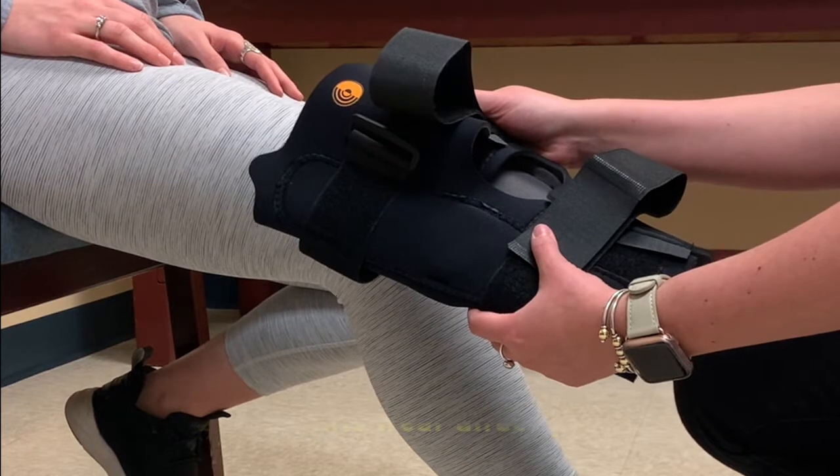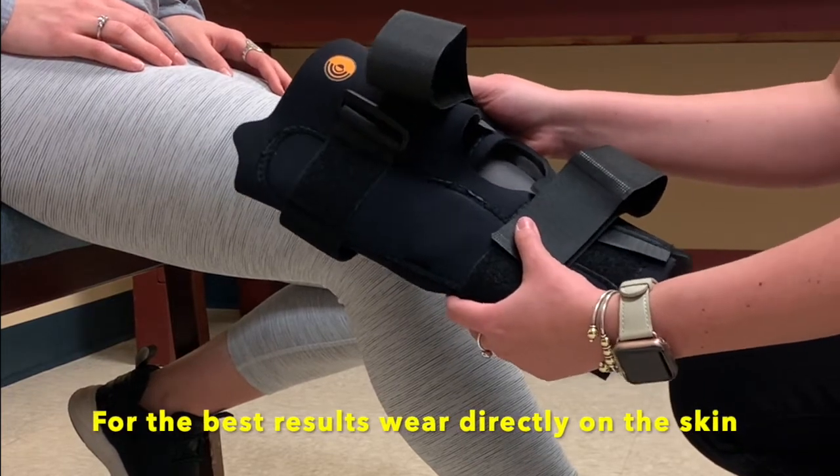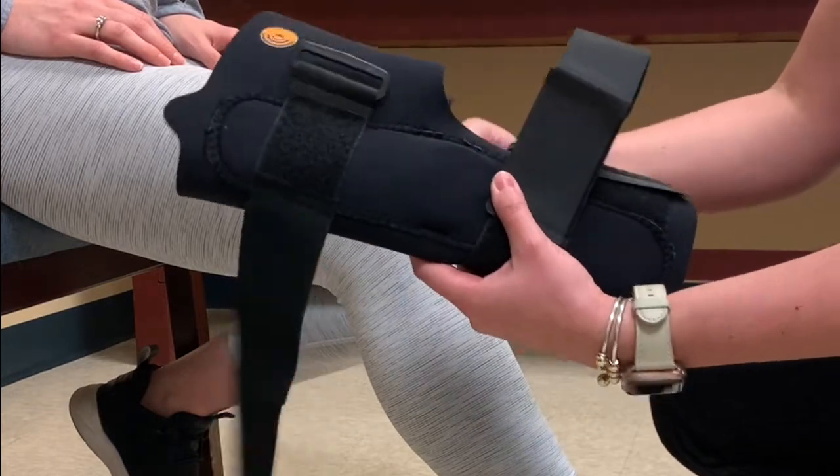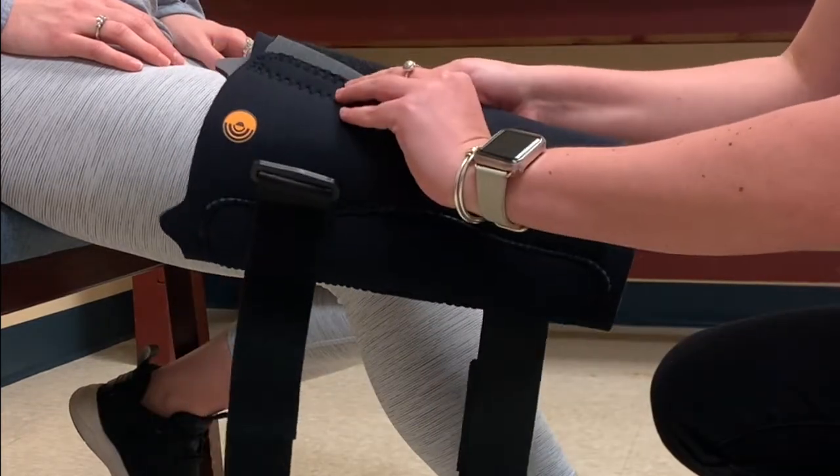For the Corflex 13-inch anterior closure knee wrap with hinge, you're going to first start by undoing both of the straps and opening up the front closure.